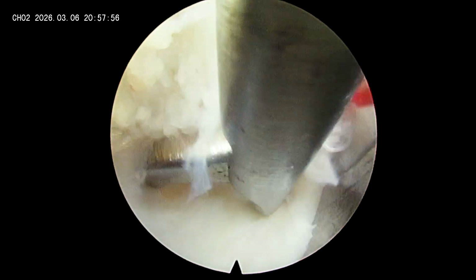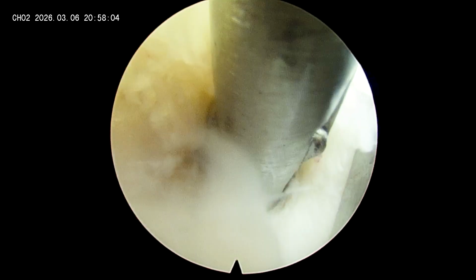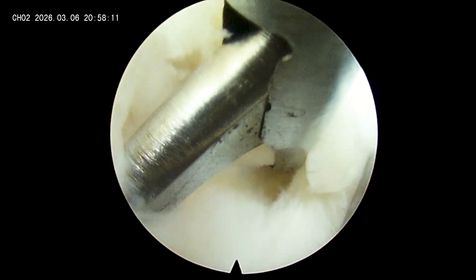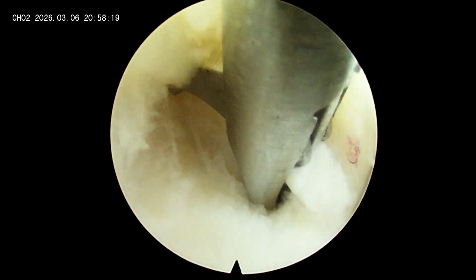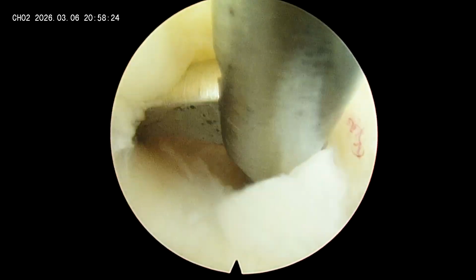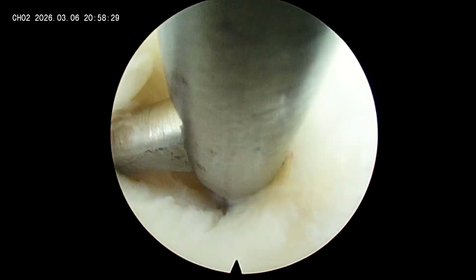I'm just using the tip of the working sleeve as a retractor. You can see here I'm just retracting the portion of the ligamentum flavum, or I would say I am stretching the ligamentum flavum, so all the layers become stretched and you can have clear access for the flavotomy here. So again same thing, I am just rotating the annular cutter layer by layer and cutting the ligamentum flavum here. You have to be very careful.